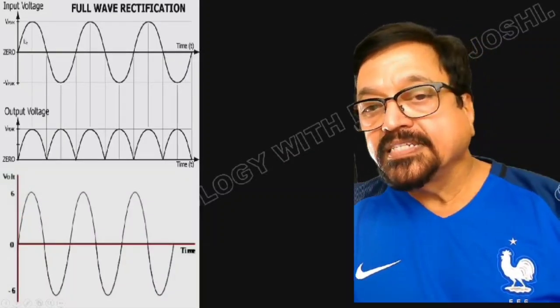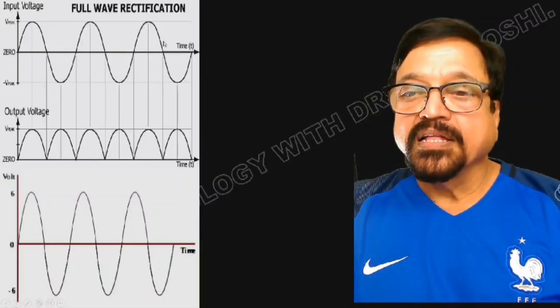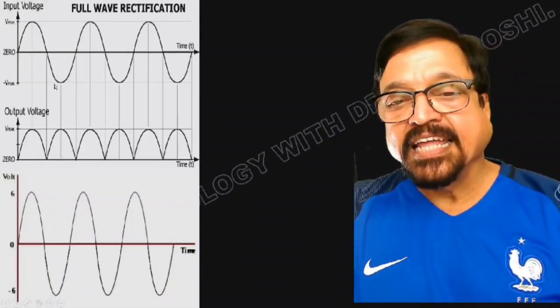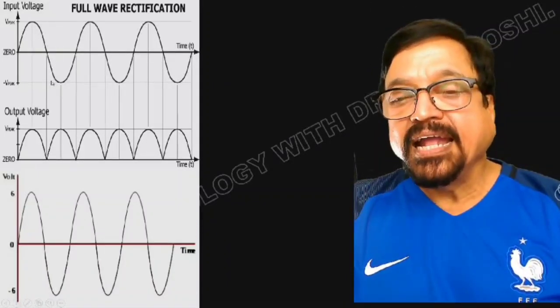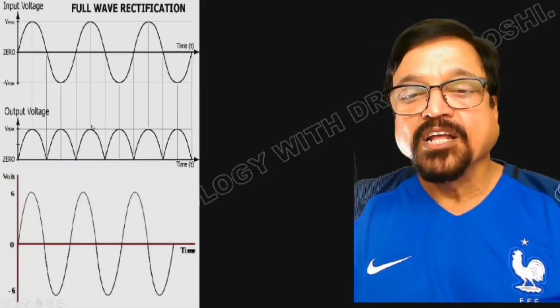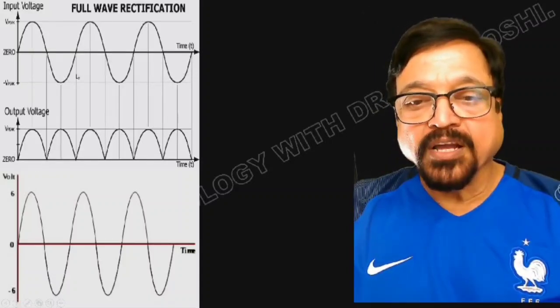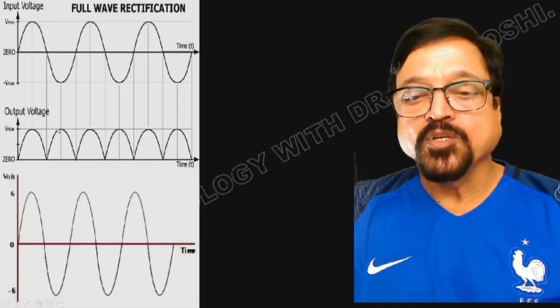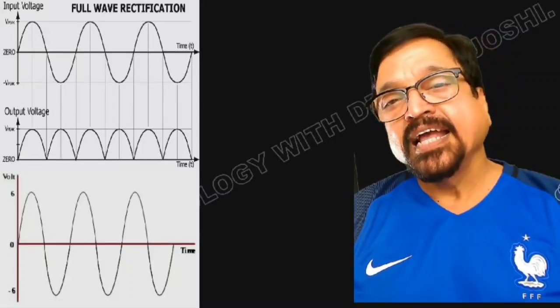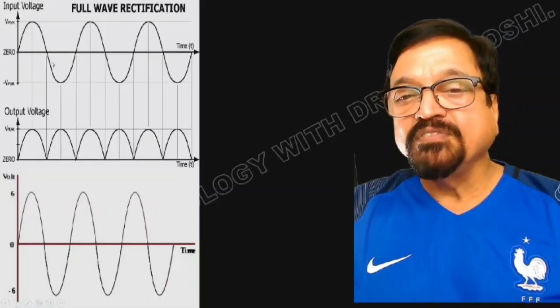Now see, here you can look at the wave. Now I'll explain. This is the upstroke, this is the down, a routine, normal waveform. This is the negative side. If you want continuous X-ray production, the ray has to move in the same direction, so this negative will not work. So what we have done is converted this negative into a positive in the output, and this will give you continuous X-ray production, which is called full wave.